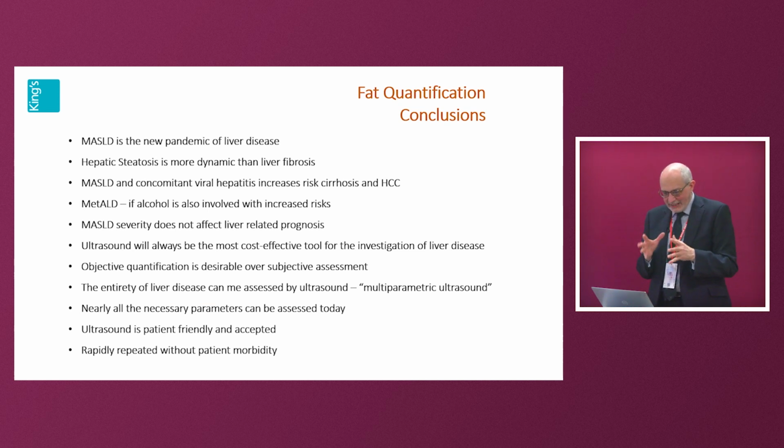And now you've got objective quantification, which is far more desirable than subjective quantification. The entirety of the liver can be assessed by ultrasound, but you can't measure the entirety of the liver with your quantification. It's just not possible. MR will do that for you, but liver biopsy never did that for you. And all the necessary parameters that we've talked about are in clinical use. They are being used, even speed of sound. But most importantly, it's patient-friendly.